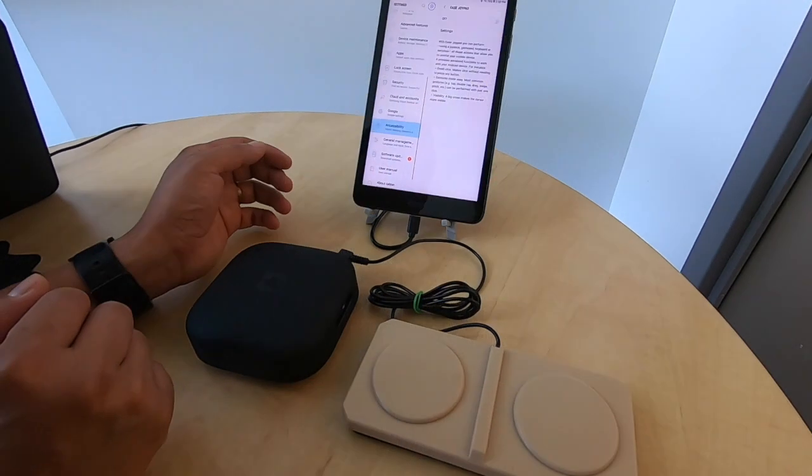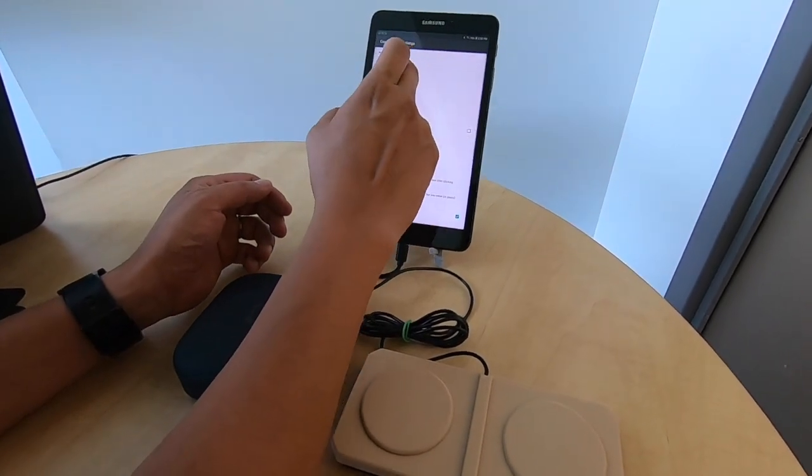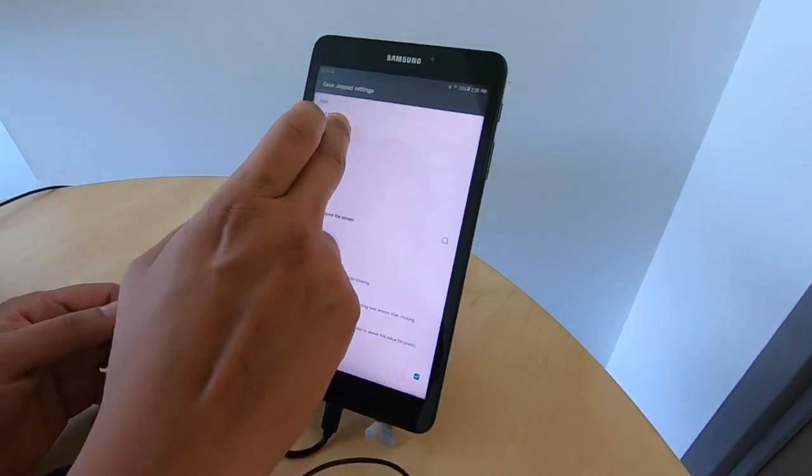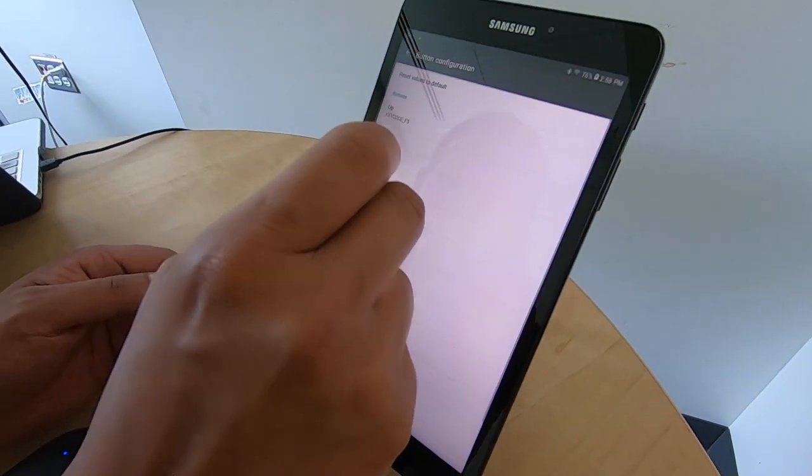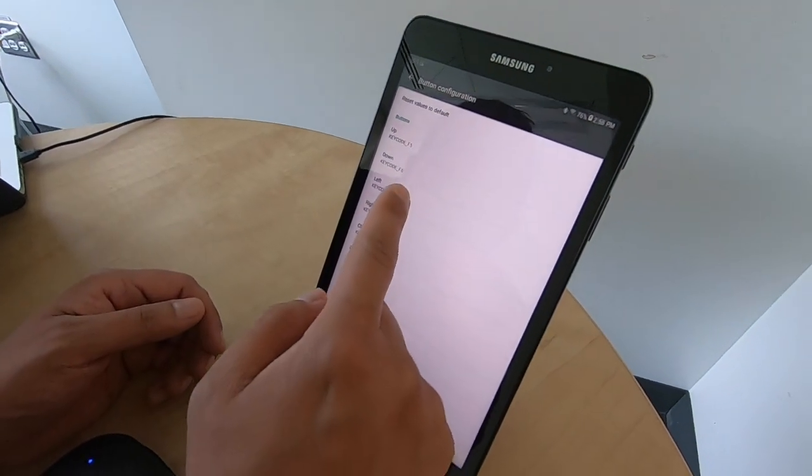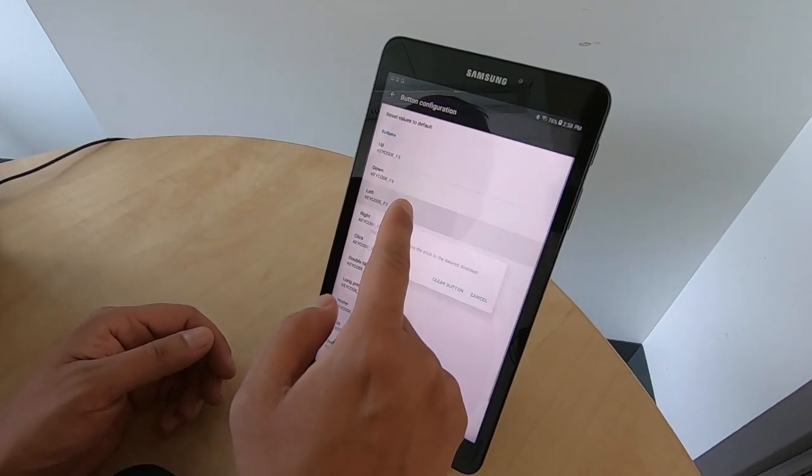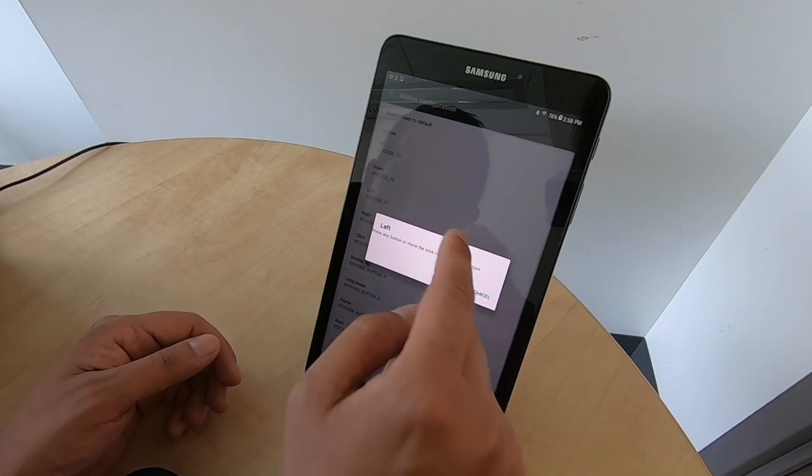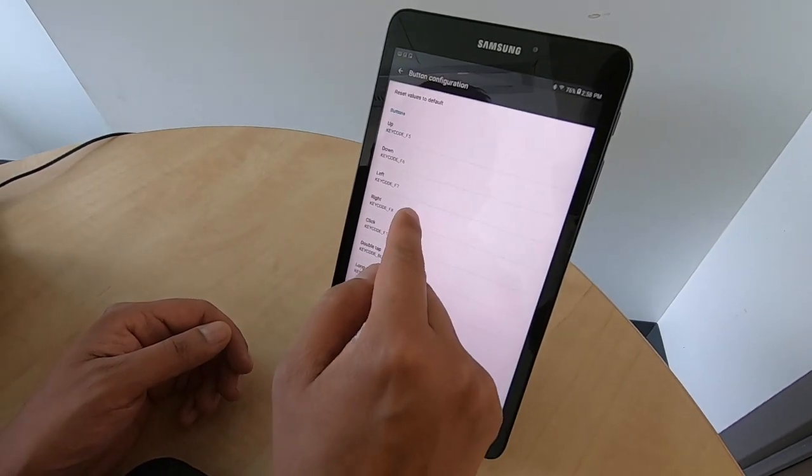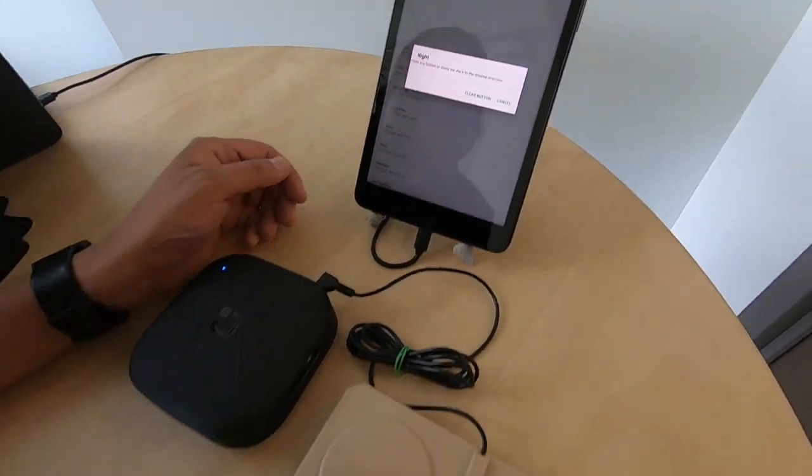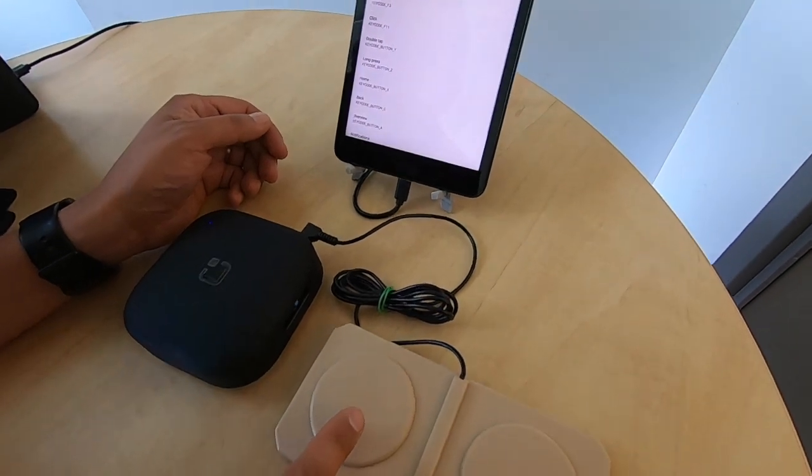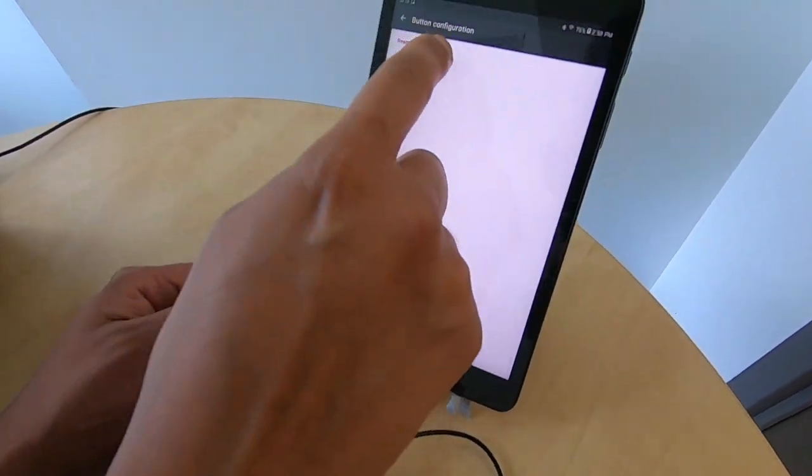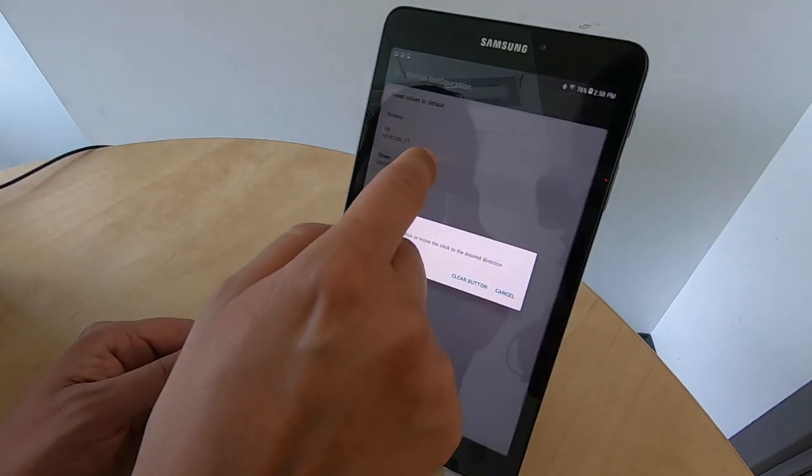Please note that the Ease Joypad app works with all ability switches, not just the joystick as demonstrated before. Now we will demonstrate the dual switch. It works exactly like the joystick but with different configurations. Watch to see how we navigate on our tablet using the Ease Joypad app and Tecla.